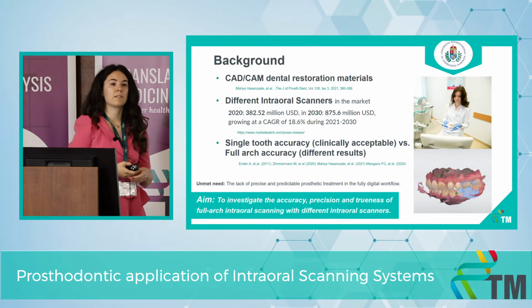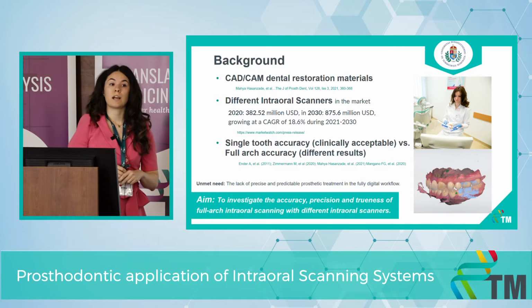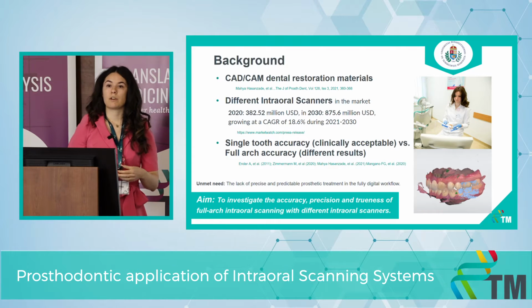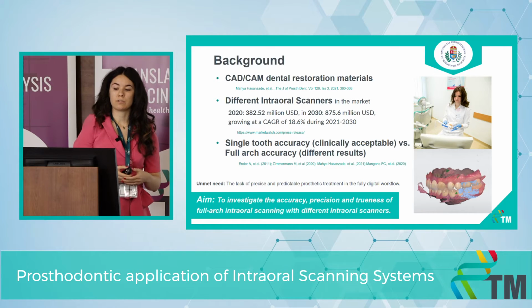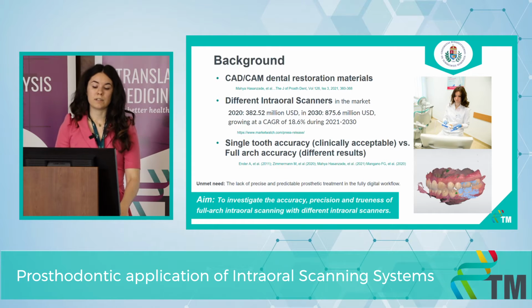Some of the dental restorations can only be manufactured with CAD/CAM technology, which is computer-aided design, computer-aided manufacturing. And to use this kind of technology, we always need a three-dimensional file, which is usually an STL file. Intraoral scanners are devices which are available for direct digitalization of arches to produce this kind of STL file.